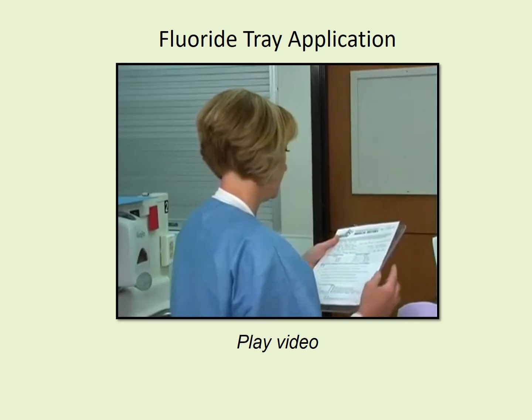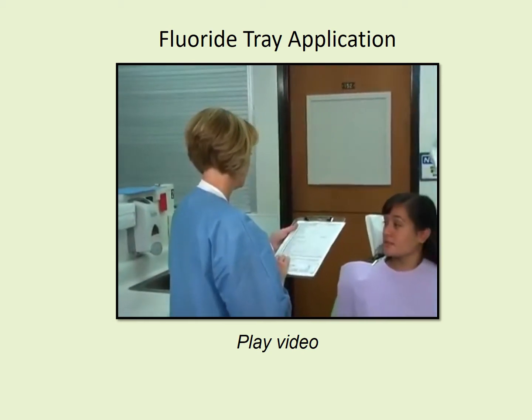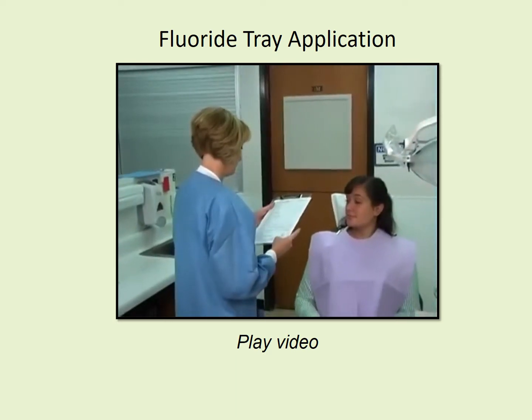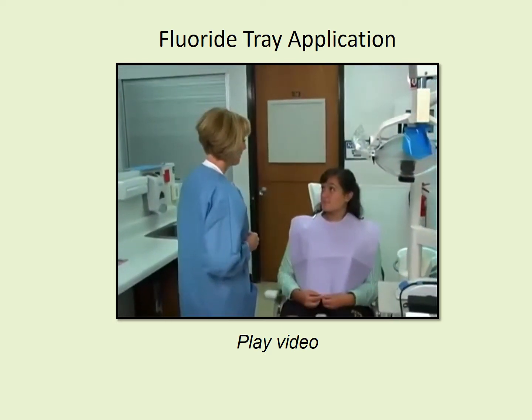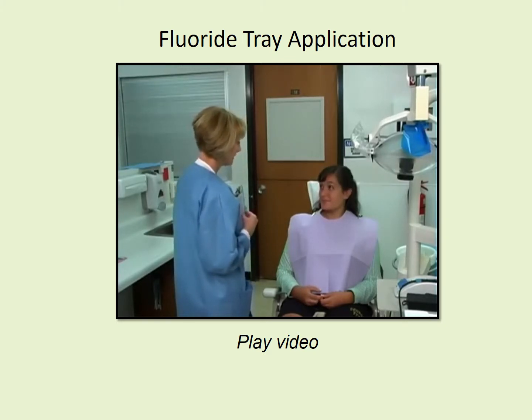Review the patient's medical history for any contraindications, such as food and dye allergies. A detailed explanation of the rationale and procedure must be given to the patient. The patient will need to be instructed to avoid swallowing the fluoride during the procedure, and that the duration of treatment will be 4 minutes.